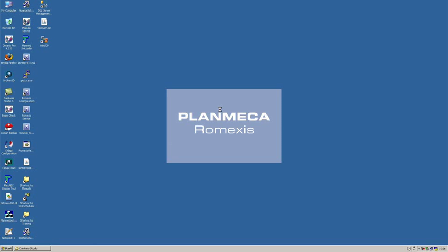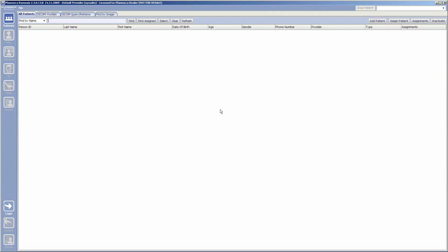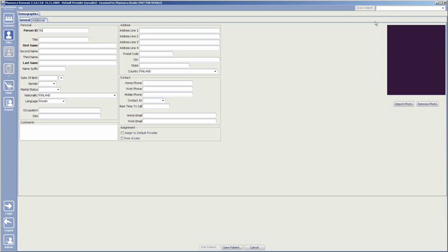Prepare the software for the new patient. Open Romexis and select a patient or add a new patient.